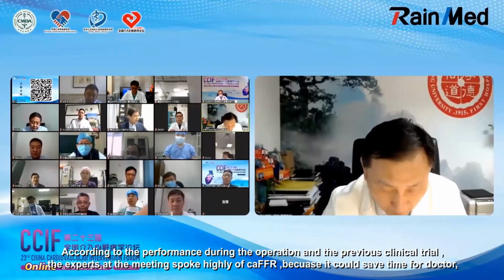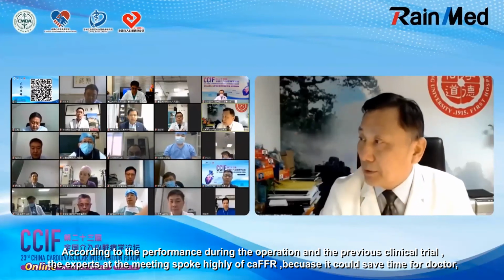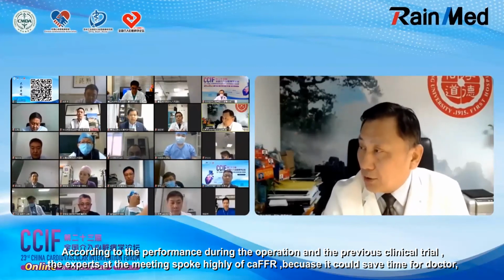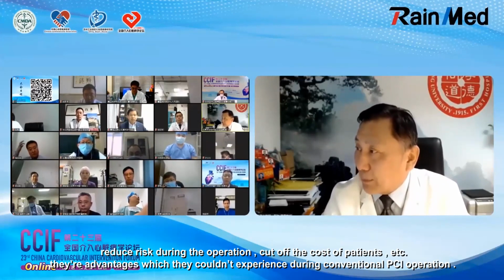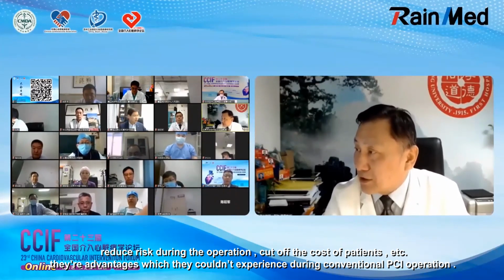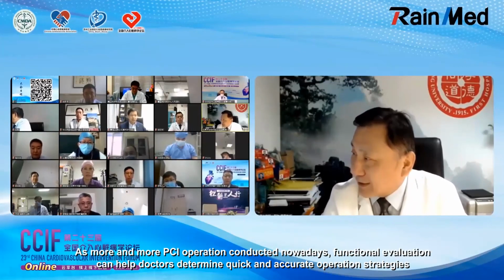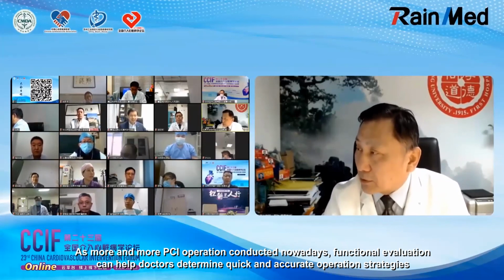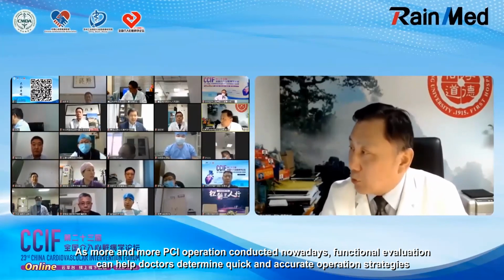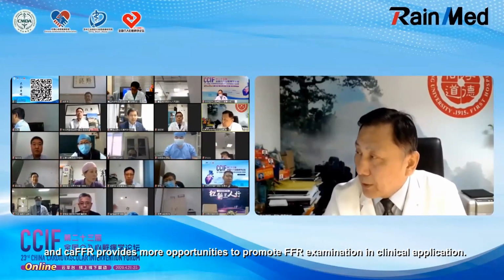According to the performance during the operation and the previous clinical trials, the experts at the meeting spoke highly of caFFR. They said it could save time for doctors, reduce risk during the operation, cut the cost for patients, etc. These are advantages which they couldn't experience during conventional PCI operation. As more and more PCI operations are conducted nowadays, functional evaluation can help doctors determine quick and accurate operation strategies. And caFFR provides more opportunities to promote FFR examination in clinical application.